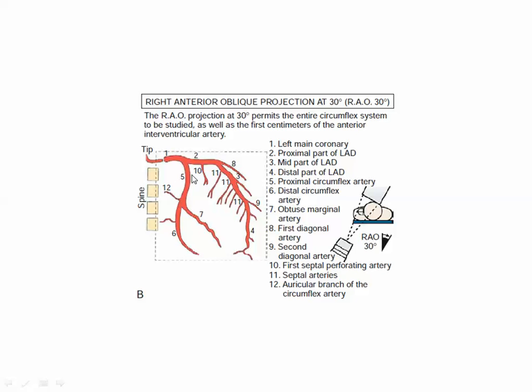Okay. While the OM, proximal OM, what? To localize the region, the same. First OM, proximal LCX. From the first to the second OM is the mid, and distal is after the second, the distal LCX.